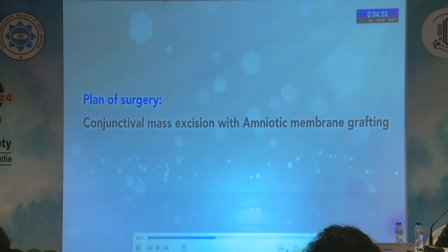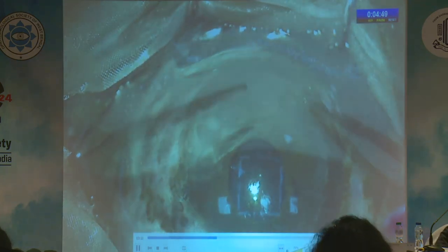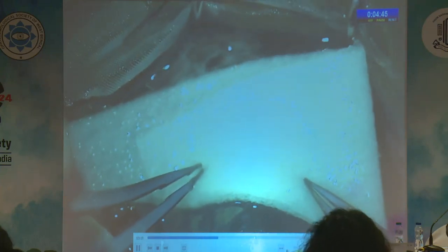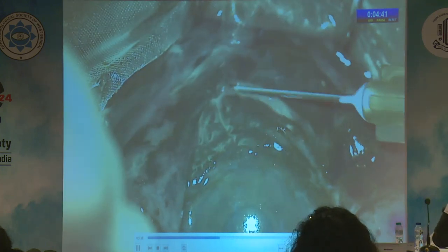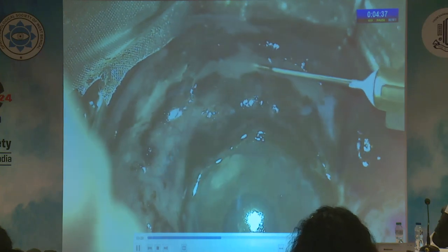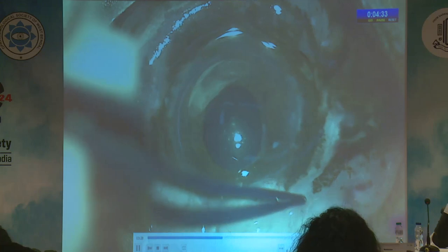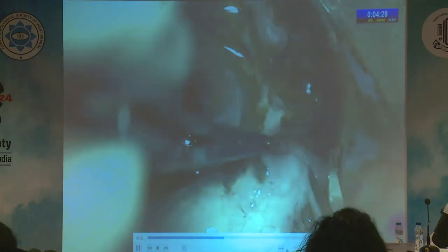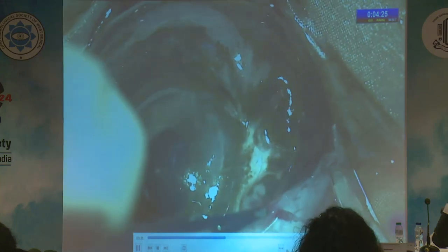after taking informed consent. Under peribulbar anesthesia and sterile dressing, an alcohol swab was pressed over the inferior cornea to loosen the epithelium near the limbus. Subconjunctival saline was injected under the nevus to elevate it from the underlying tenons in the area to be dissected. Excision of the conjunctiva was started from the superotemporal sector of the globe over the tenons plane, keeping a 3 mm safe margin.